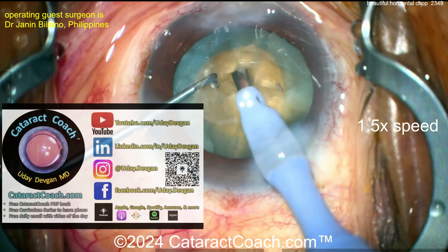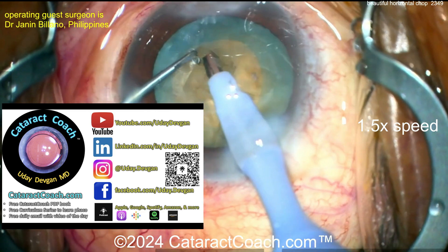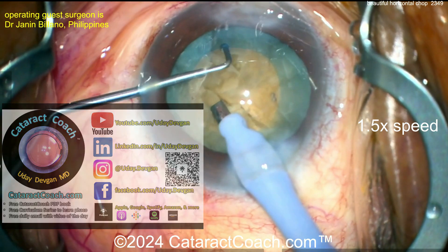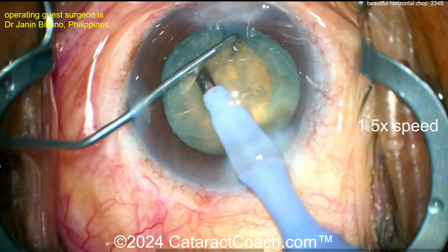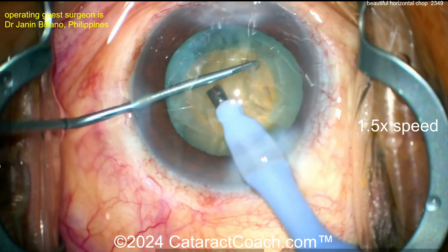Let's see if you can get one quadrant out now. Remember, if you're a resident who's learning, there's so much great material on the cataractcoach.com website — a full-on curriculum with lessons for free that teach you how to do FACO chop. What's the FACO power? What's the vacuum setting? On cataractcoach.com I've got a whole series of FACO fundamentals where you can learn how to choose your own settings, stop copying other people, and do what makes sense for your technique and your hands.